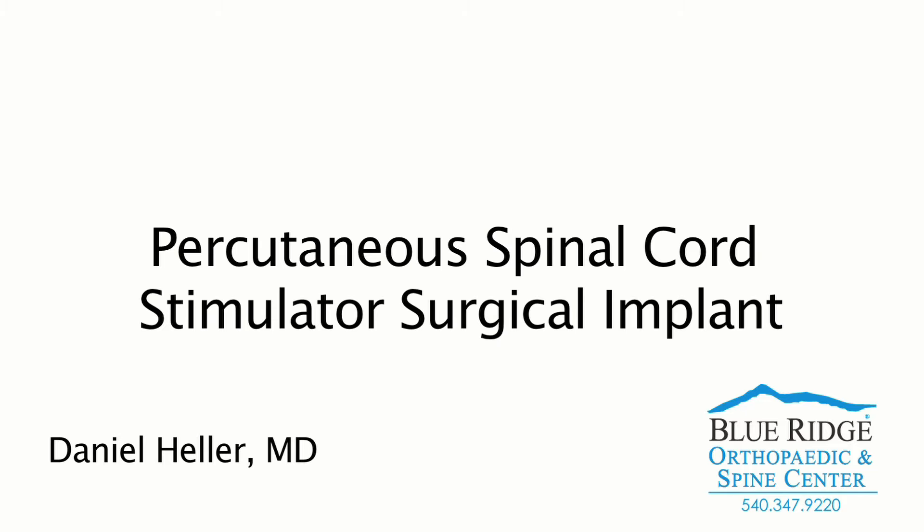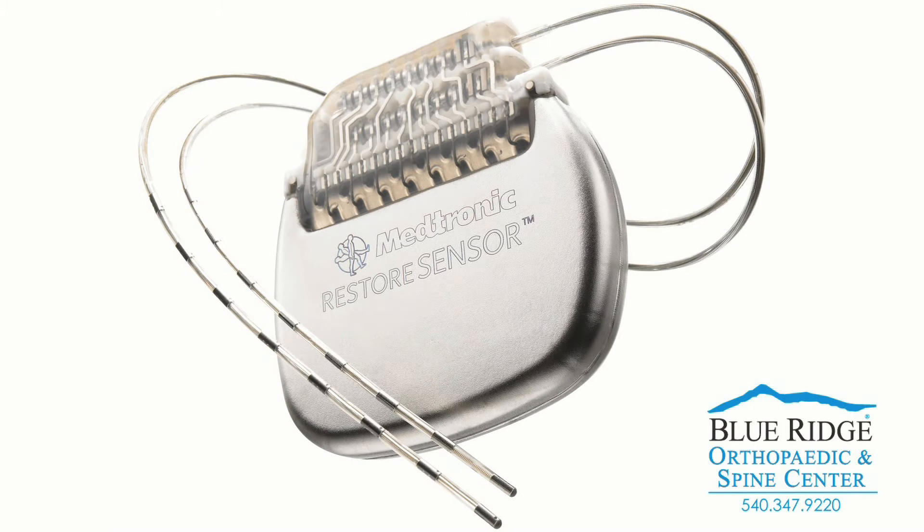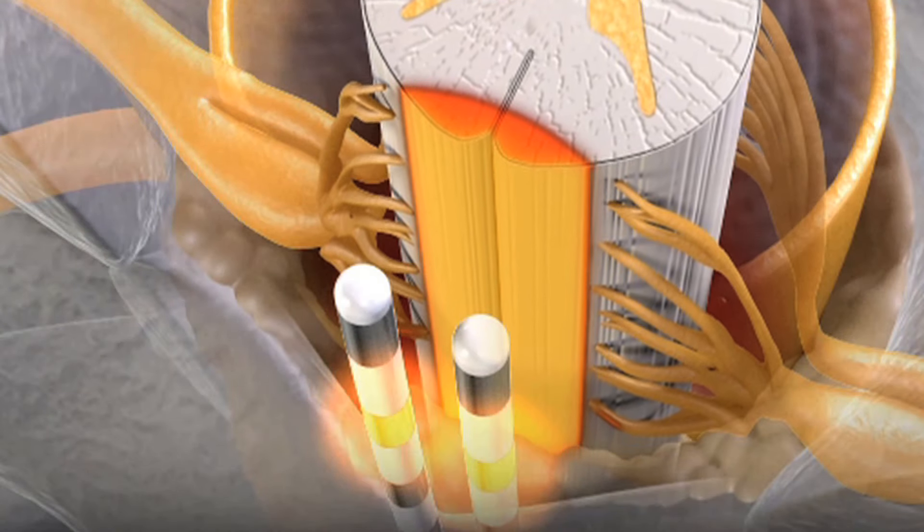This is a video of a minimally invasive percutaneous spinal cord stimulator implant using two electrode leads. A spinal cord stimulator is a device to help manage chronic pain.